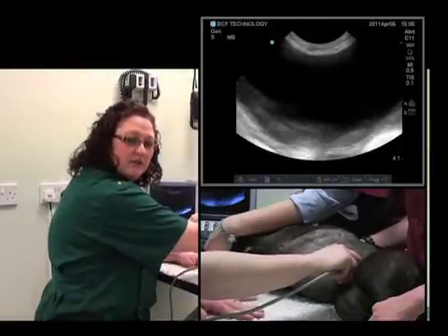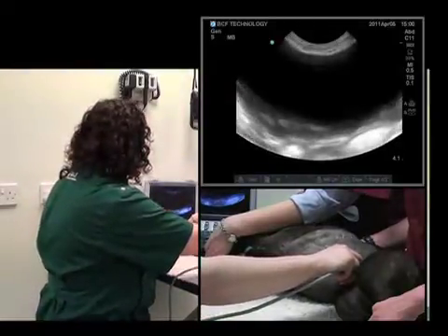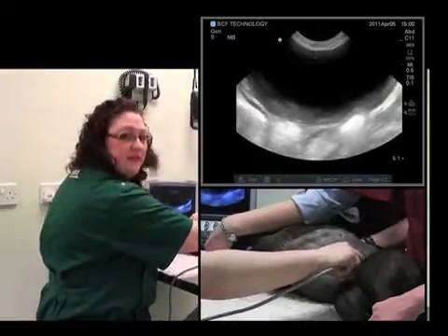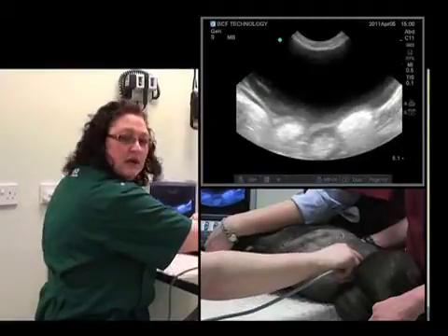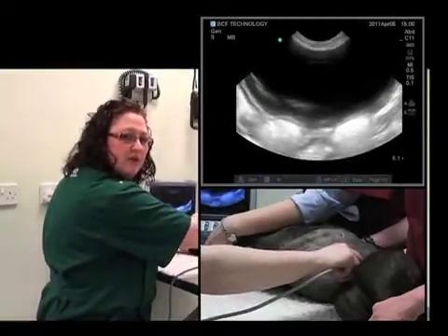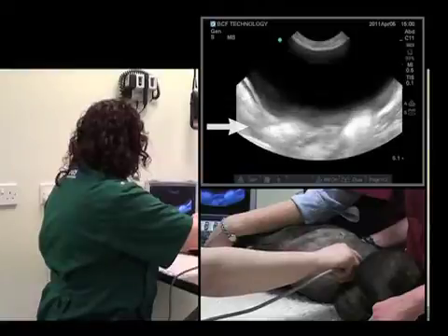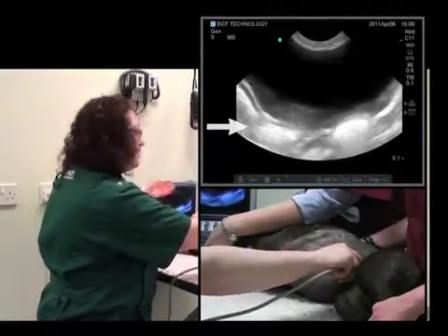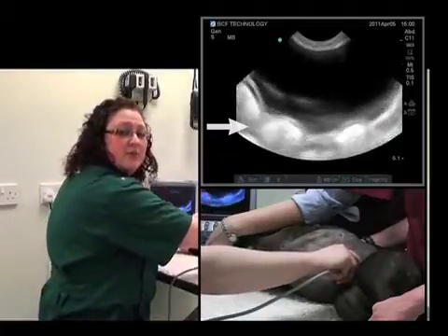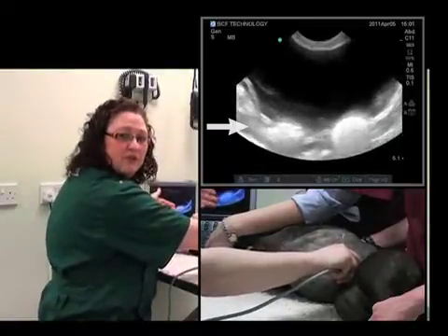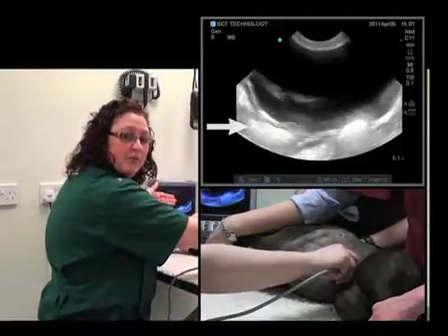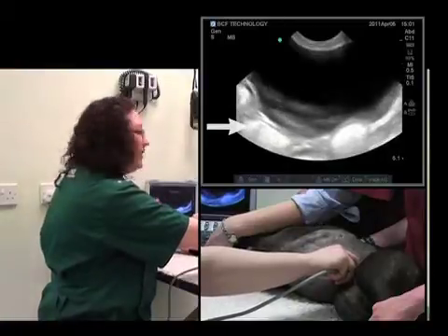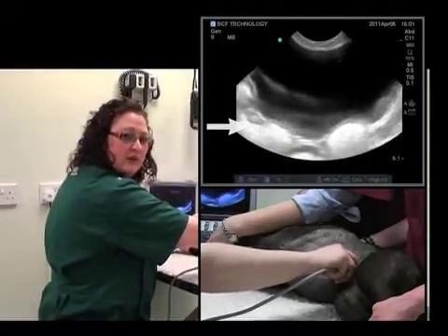We'll need to adjust the depth, the gain, and the time gain compensation. This looks a little bit too bright in the far field. This is a result of the fact that the echoes are not being attenuated as they go through the bladder — they're not coming against any resistance — so the deeper tissues underneath the bladder are a bit brighter than they actually should be. This is called acoustic enhancement and is an artifact, so we'll need to adjust for this with the time gain compensation.